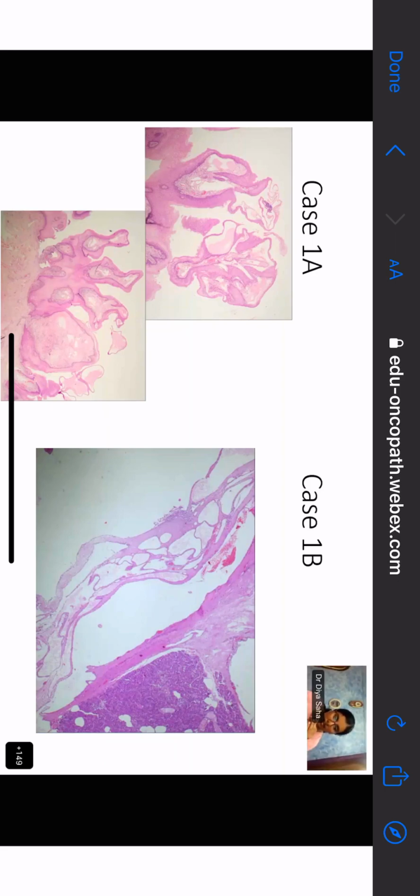So how would you describe this? Ma'am, now I would say that it is an exophytic growth having a stratified squamous lining, and there are some cystically dilated spaces in the subepithelial region. Yes. And it's not just some cystically dilated spaces. There are numerous cystically dilated spaces, some of them filling the entire stromal content of that exophytic squamous lesion. Isn't that so? Yes, ma'am. So this is not a true papilla, because if you make the mistake of just calling it a papillary lesion, you may come to the wrong conclusion.